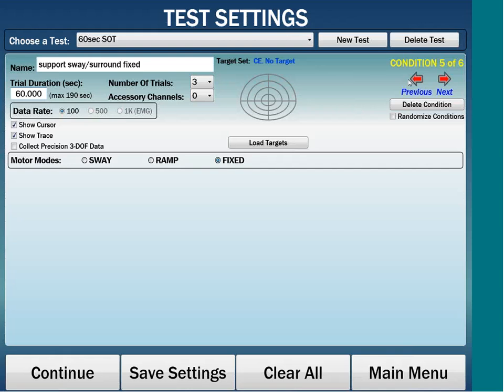I will enter a post-test comment. Your shoes. This is important. And the data would be uploaded after the trial. Now, in contrast to the CRS system, the data is streamed real time and there is no such delay. The data is present at the moment that you end the test. So it's a much faster operation of the software, higher utilization, etc.